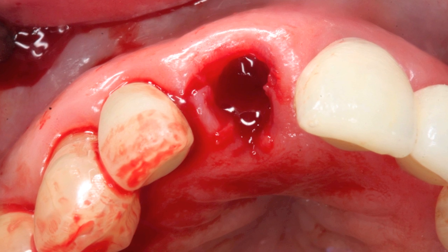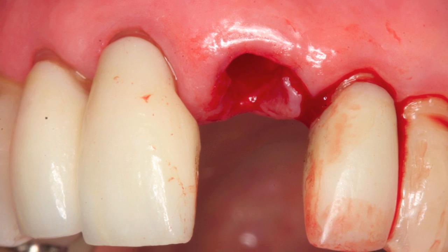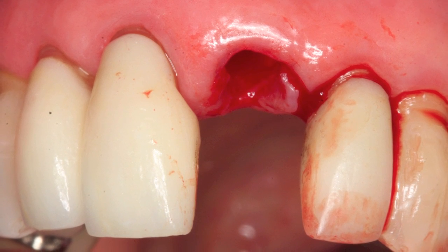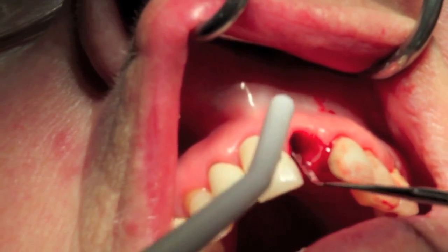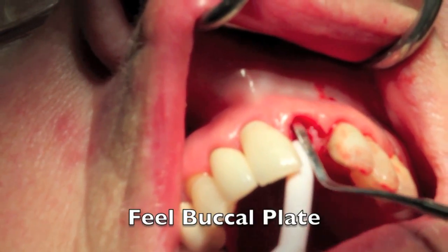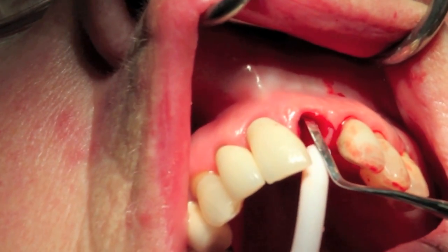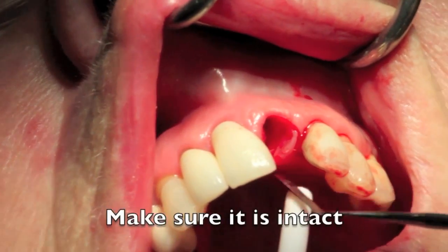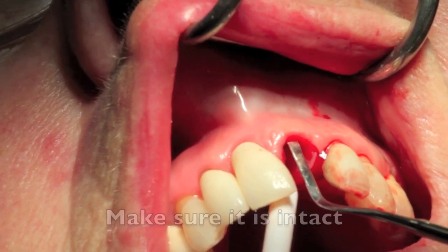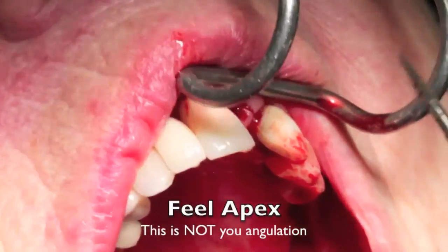So as you can see, the root came out fairly easy. Once the root is out, it's our goal to assess the situation and see if we're able to do an immediate placement. So we take the periotome and feel the buccal plate and make sure it's intact, because if it wasn't intact, I would usually abort this procedure and go to typical ridge grafting. But we do have a nice buccal plate here.